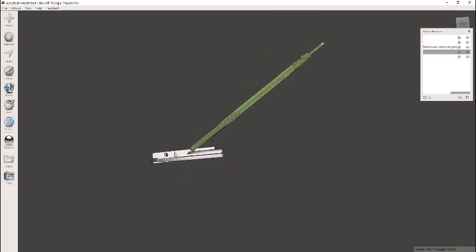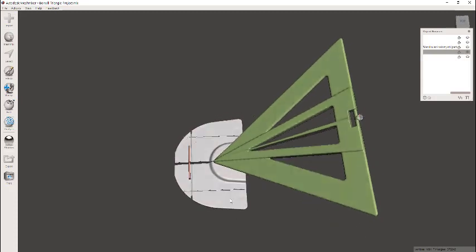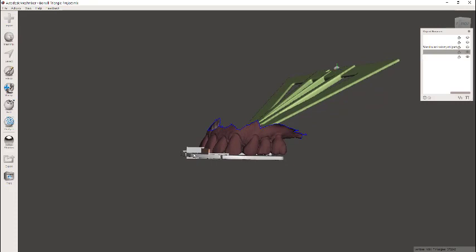And then you've also got this, and this looks very similar to the Panadent mounting plates if you're familiar with this, but the only purpose of this is to help you align the occlusal plane. Okay, so when you bring in a set of models, you're going to want to put those with the occlusal plane of the maxilla right on this.